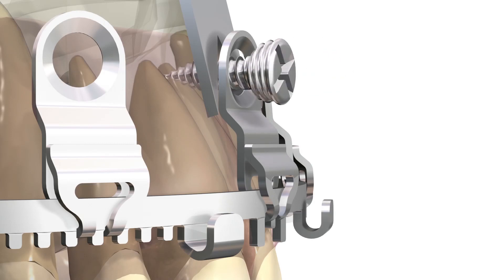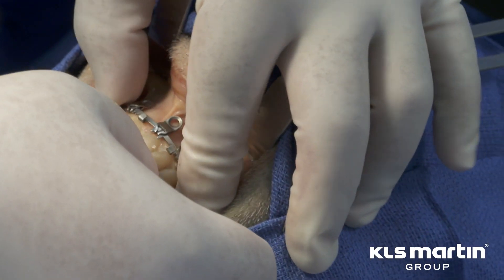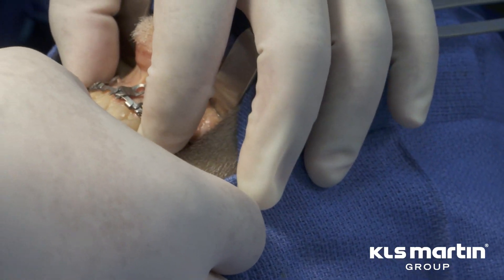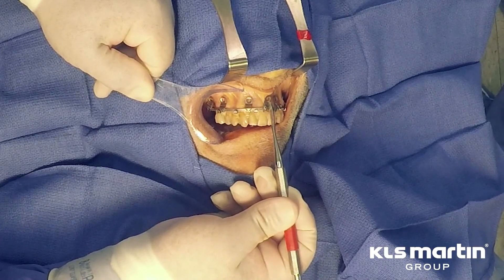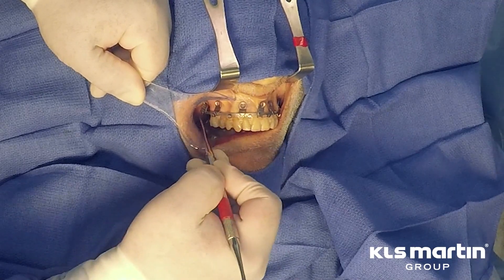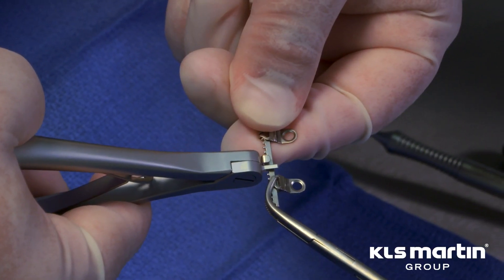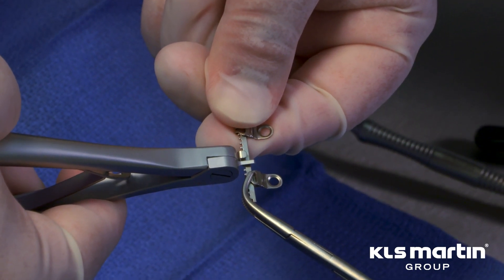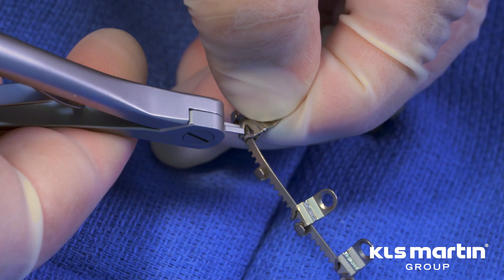The plate spacer fork also aids in lifting the plate during fixation. The first step in applying the plate is to contour it along the arch. Define your midline and then plan your use of the slider plates along the arch to the molar region. Fixation of at least five slider plates is recommended. If the arch plate is longer than you need, you may trim the plate using the L1 MMF cutters. Unused slider plates may also be removed with the same cutter.